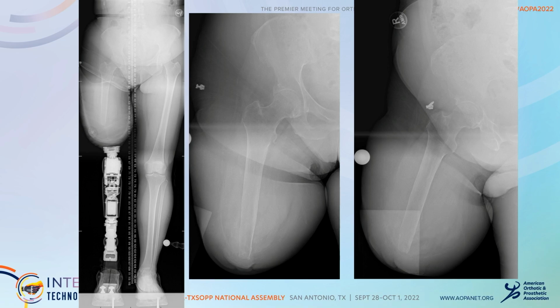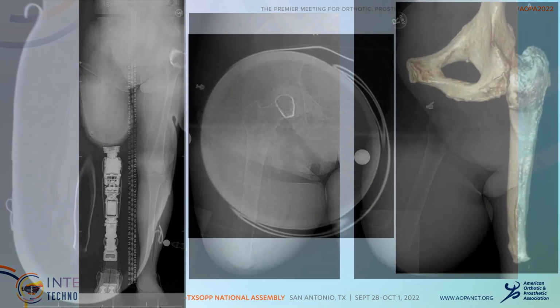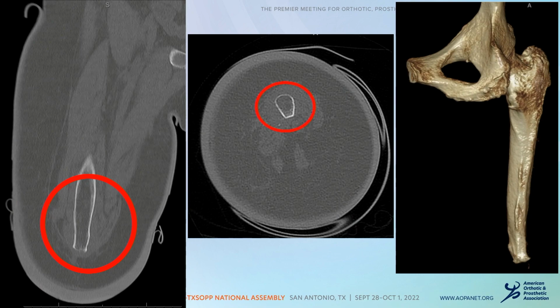Here's a case example that we performed. So some of the things that we look for are overall length, quality of bone, and alignment in their preoperative evaluation. As a surgeon, and this is important that we partner with the prosthetist, we have to plan not only where is the resection of the bone and how much we shorten them.